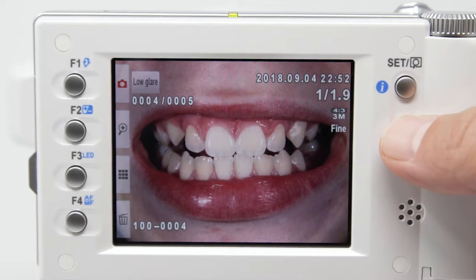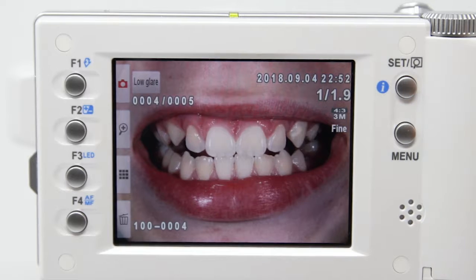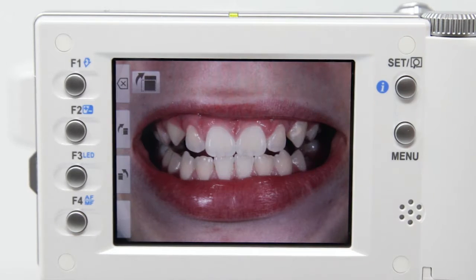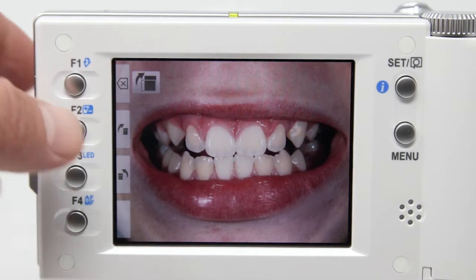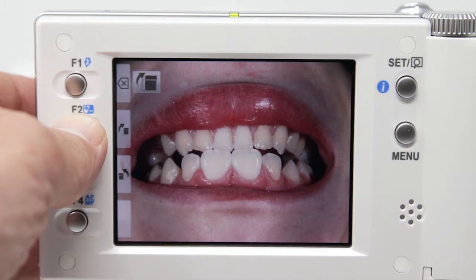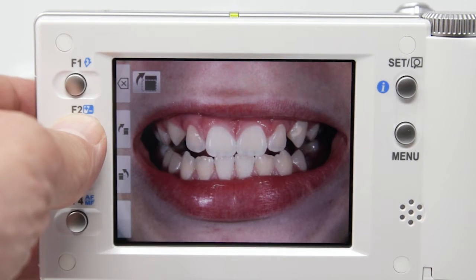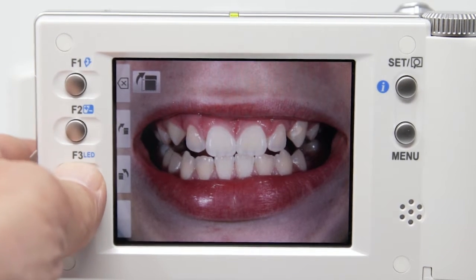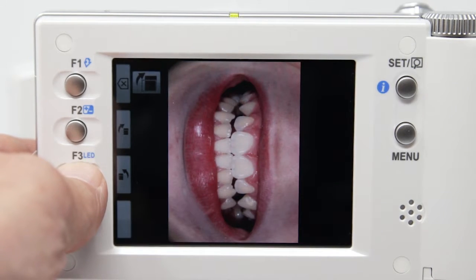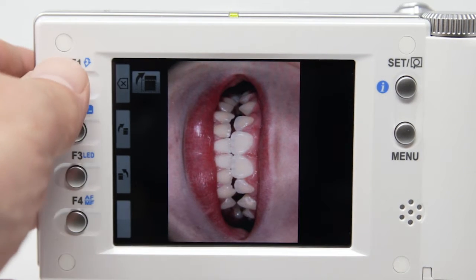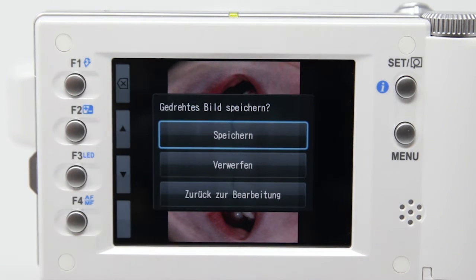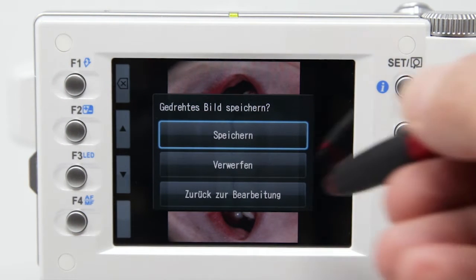You can rotate your images after choosing the rotate option from the menu. Use the F2 key to rotate your photo clockwise by 90 degrees, or the F3 key to rotate it counter-clockwise by 90 degrees. When using this function, you can also save the edited images — press the F1 key and choose the save option.